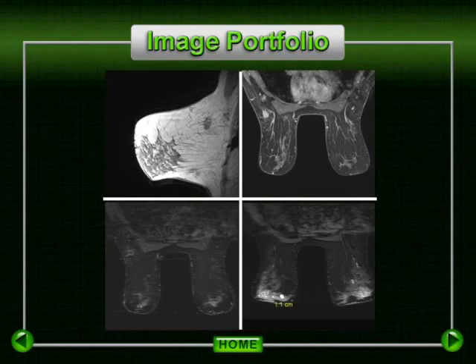Once you put all of the work into providing a high-quality exam and a high-quality interpretation, you want to be able to relay that information to referring physicians so they can get the maximal benefit from it. In order to accomplish this, we feel that it is critical that you develop a standardized method of presenting your images to your referring docs, and that you do it with every patient. They will quickly become accustomed to a format where they can easily and in a very short period of time review each case. They will then see time and time again the benefit that you are able to provide them and their patients with this phenomenal imaging technique.